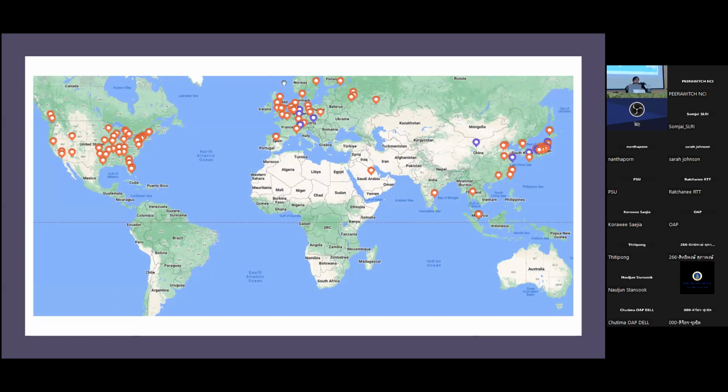And the proton centers vary all the way from maybe 4 tumor rooms in a facility to single rooms. Originally, when proton was first starting out, there were larger centers, maybe 3 or 4 gantries. Then as the technology evolved and more places wanted to open and couldn't build such large centers, there came more 2-room and now a lot of 1-room solutions, similar to what's here in Bangkok. This just shows overall how many centers there are, and there's the one in Bangkok here.